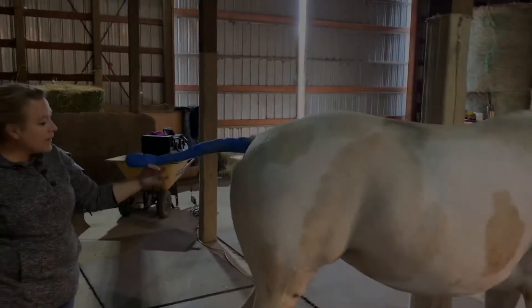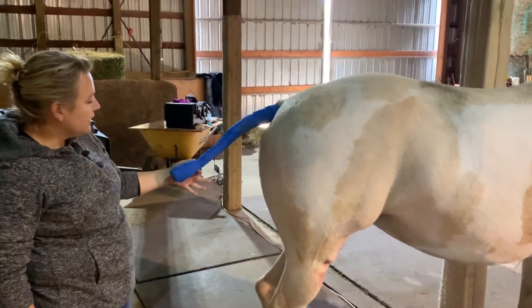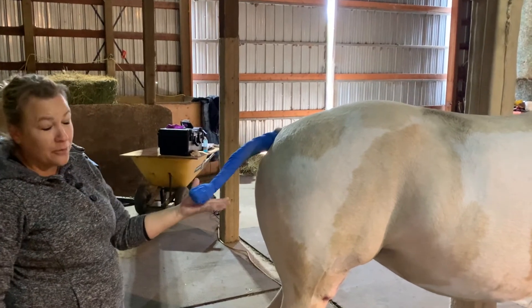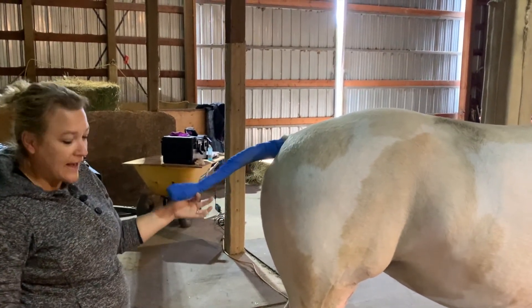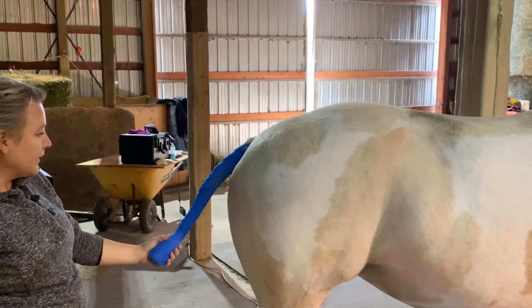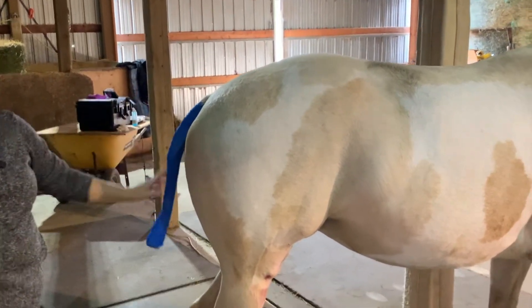When I do back leg injections, I always do a nice wrap of the tail. This will hurt when they hit you in the head with it, but you won't get hair in your sterile field — you won't get a horse really swishing their tail into your work area. I do wrap tails.